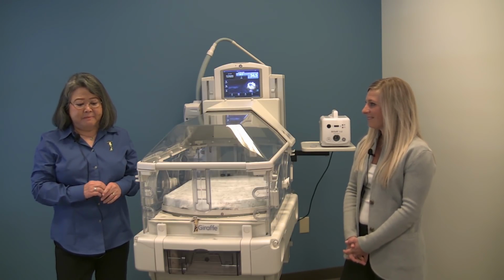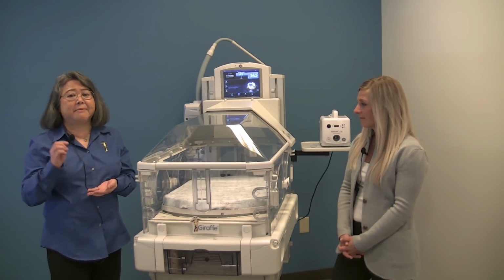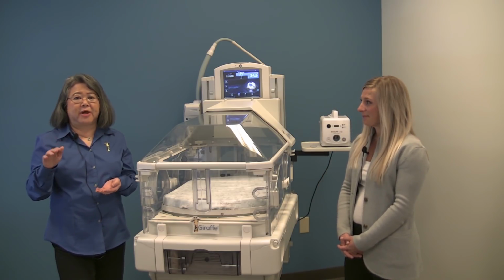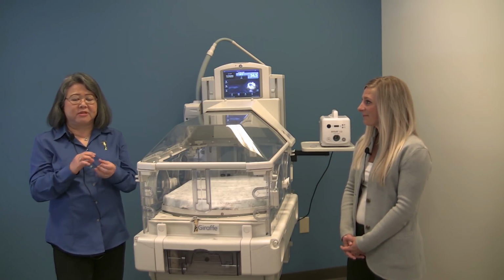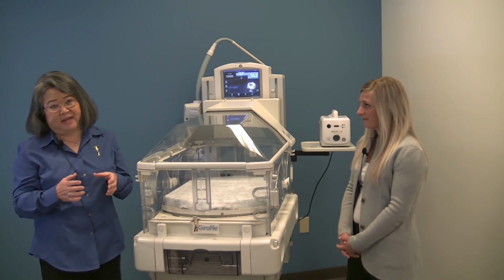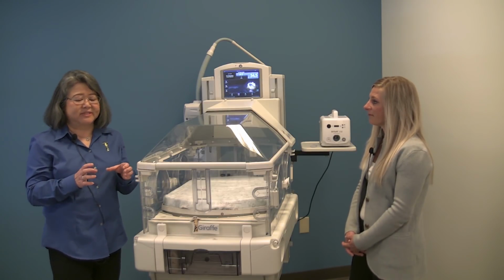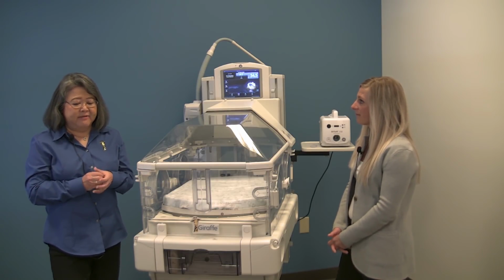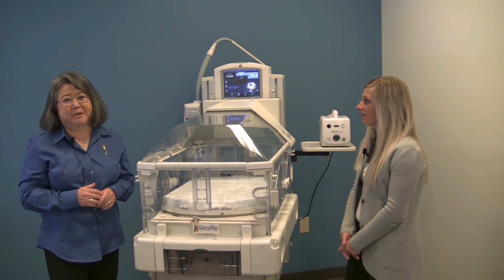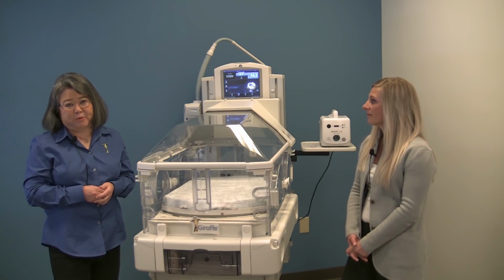Then the bili blanket came about, which was a fiber optic pad, but the light source was still halogen. Even so, we were able to deliver light through the fibers to the end of a pad. However, the limitation was the size of the pad. It was only a 4x6 illuminated area, so not a lot of surface area. But eventually, we came out with the BiliSoft, and then there were other versions of spotlights, but today we know blue LED light source is what we want.